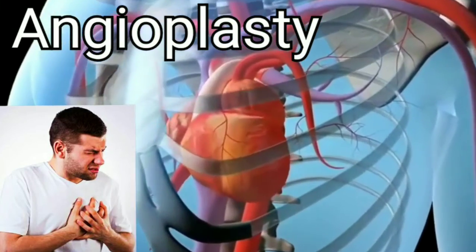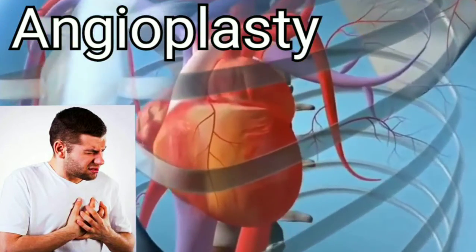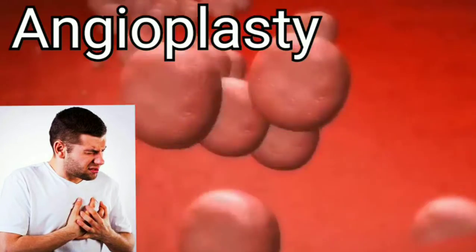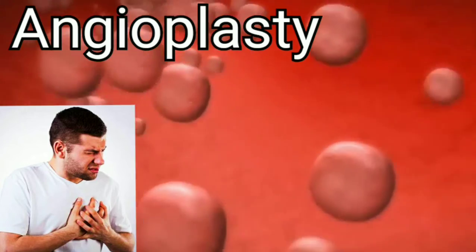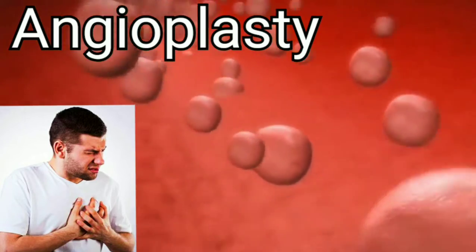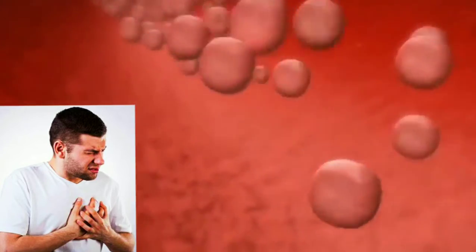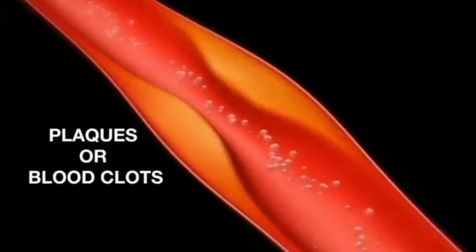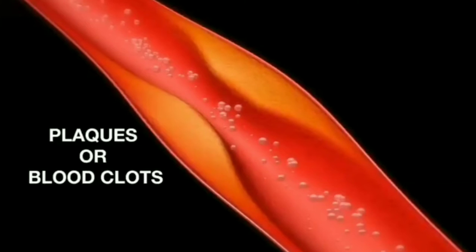Hello viewers, today we see the process of angioplasty. Angioplasty is a conventional treatment for coronary heart disease, that is CHD, and heart attacks.